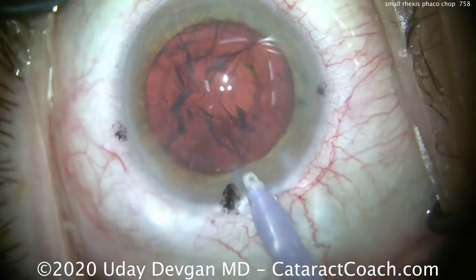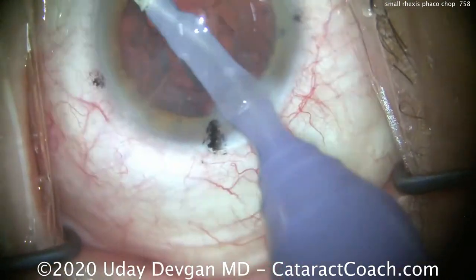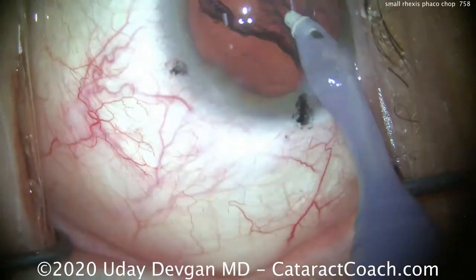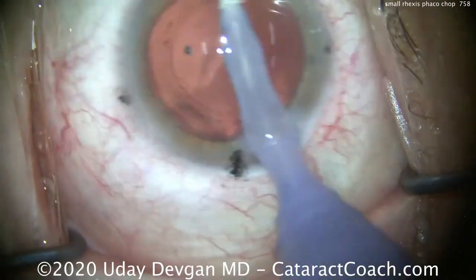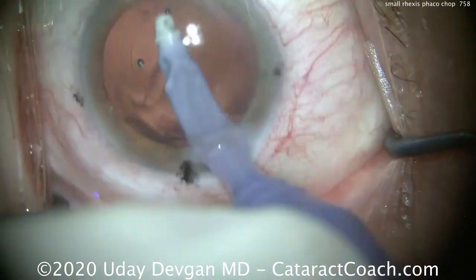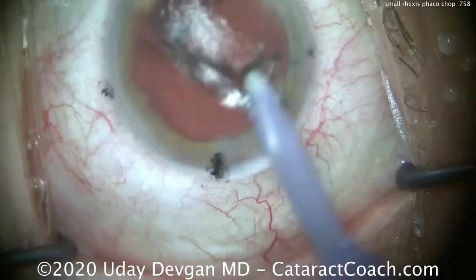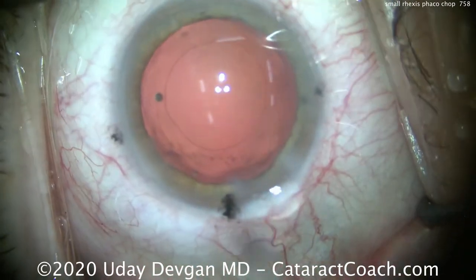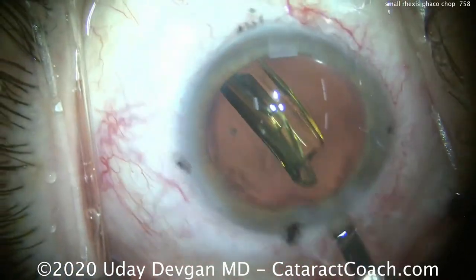Phaco chop definitely works very well in essentially all shapes and sizes of capsulorhexis openings. Ideal for me is five to five and a half millimeters — then I can simply split the nucleus into two halves and bring up each half for emulsification or further sub-chopping. But when I have a slightly smaller capsulorhexis like in this case, we want to bring up just one corner of each heminucleus at a time and chop off that corner. That's an easier way to bring up just part of it through that smaller capsular opening.